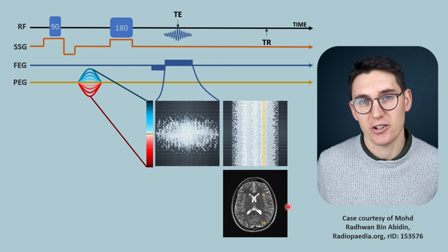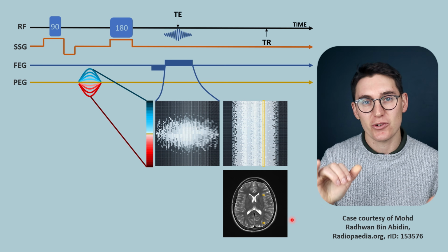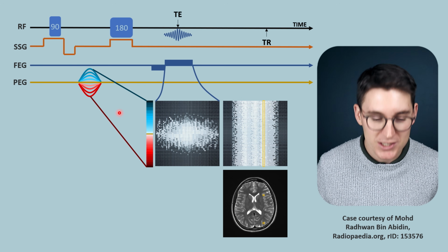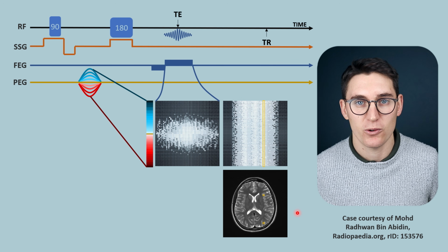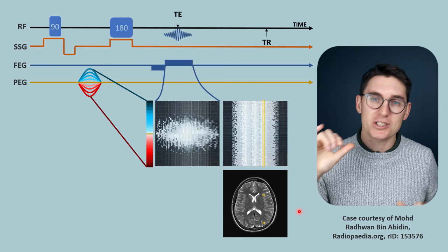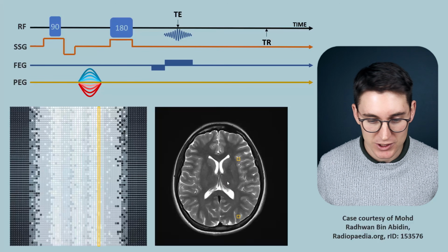The second assumption that we're going to make is that we can calculate the degree of phasing that is required for the spins in either of these 2 pixels to be 180 degrees out of phase with one another. Now this isn't a false assumption. We know the phase encoding gradients that we're applying to the slice that we've selected, and we know the location of the pixels that we are trying to calculate the signal value for. And there is a mathematical formula that will allow us to calculate which degree of phasing, based on the location of these 2 pixels, will cause the spins to be 180 degrees out of phase with one another. We're not going to actually calculate that, but it can be done. So let's have a look at these 2 in closer detail.